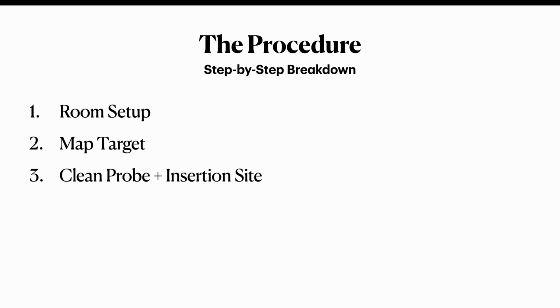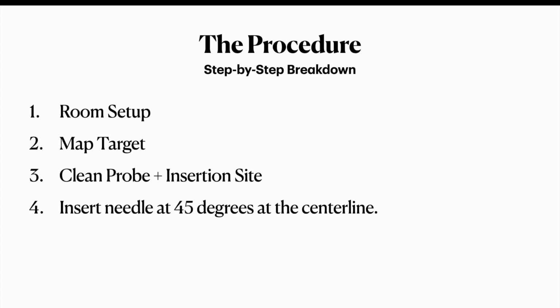Ultrasound guided IV insertion is a lot like standard IV insertion with just a few tips and tricks. We've set up our room and mapped our target. We will briefly cover how to properly clean the probe and insertion site. For the actual procedure, you will start by inserting the needle at 45 degrees at the center line. You will then attempt to locate the needle, and I will explain what this means when we get to it.